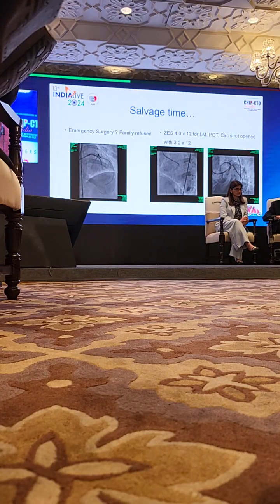So the next step, we immediately went and spoke to the family and requested that the next best thing would be emergency CABG, which the family point blank refused. So we went in, stented the left main from the ostium with a 4/12 pot, rewired the circ, opened up the circ struts, got flow back, but something did not feel right, and the next stent boost that we took showed this.